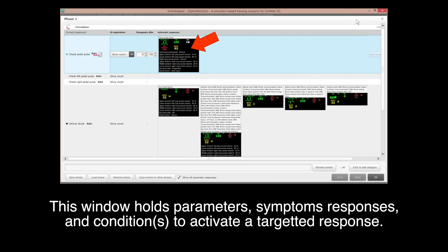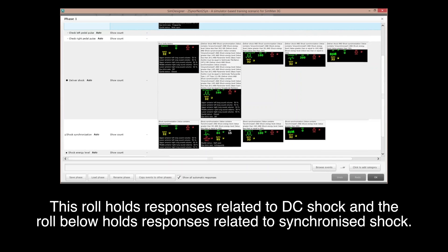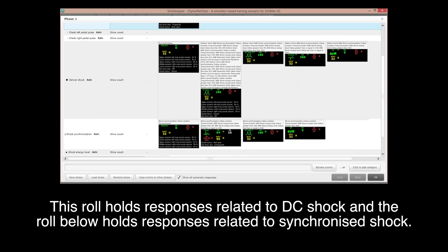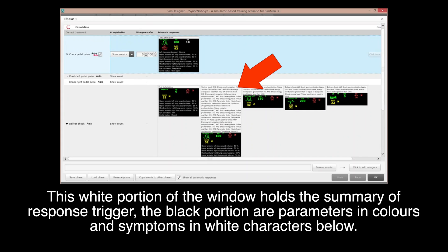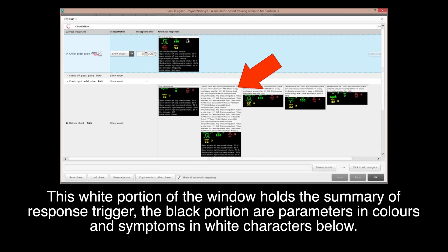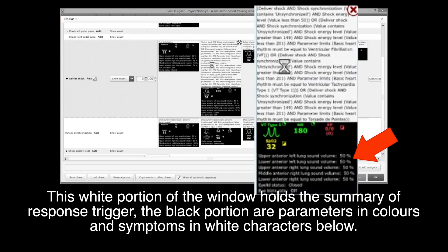This window holds parameters, symptoms, responses, and conditions to activate a targeted response. One row holds responses related to DC shock, and the row below holds responses related to synchronized shock. The white portions of the windows hold summaries of response triggers; the black portions are parameters, with symptoms in white characters below.